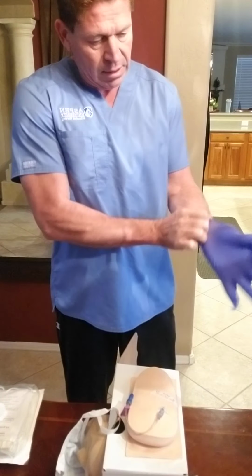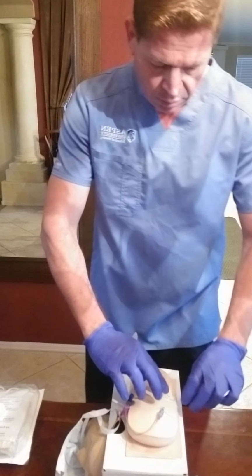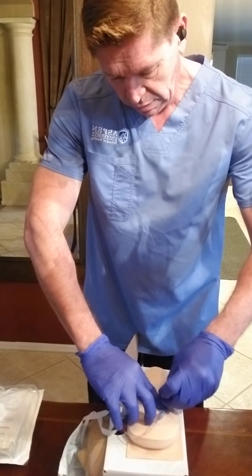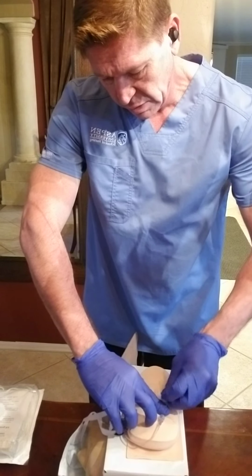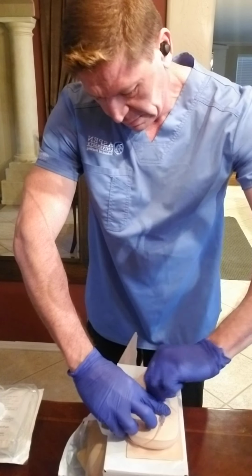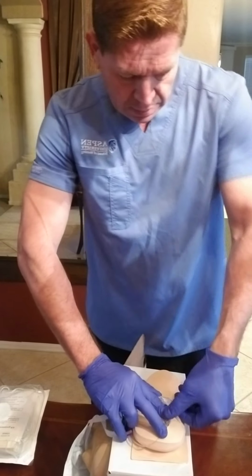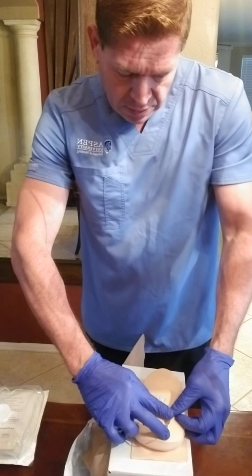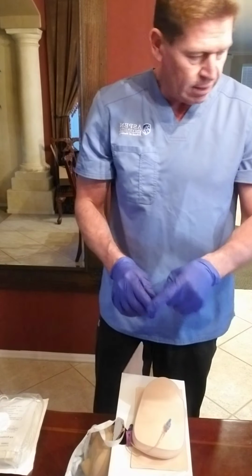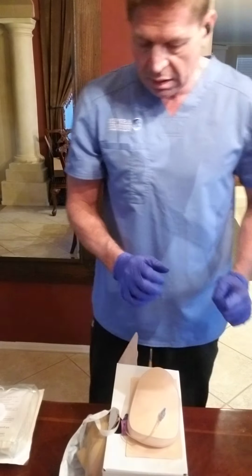And I'm going to start removing the old dressing, and I'm gonna work from the outer edge towards the center, towards where the line enters the port, enters the skin. And I'm gonna do that all the way around, making sure that I don't pull on the line. And this is going to go in a biohazard bag, so I'm putting it there.